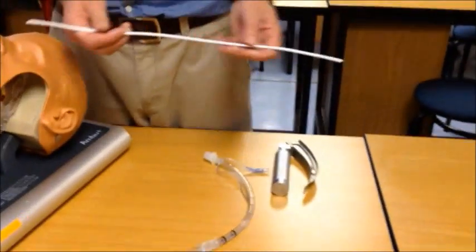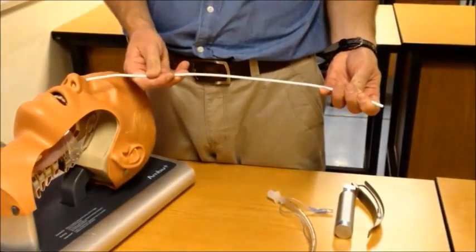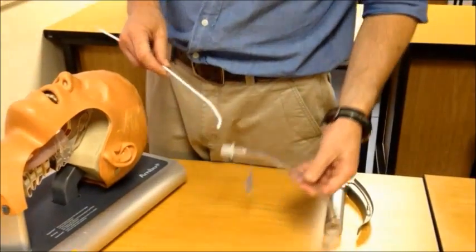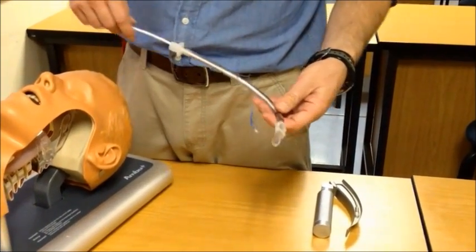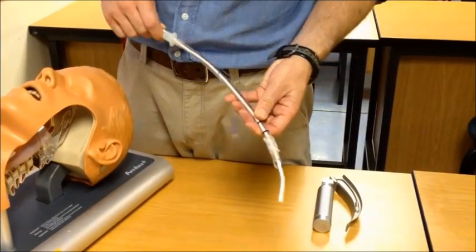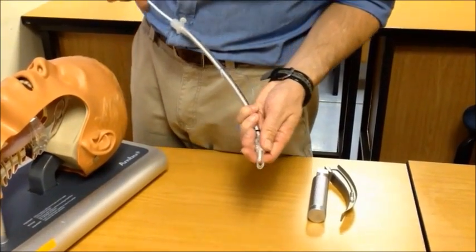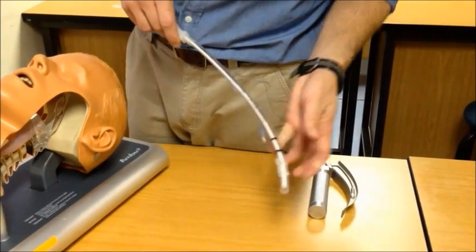If you decide to use a formable introducer or stylet device, take your ET tube, insert it along the ET tube and take care that it should not pass beyond the edge, but rather stop just before the edge of the tube.